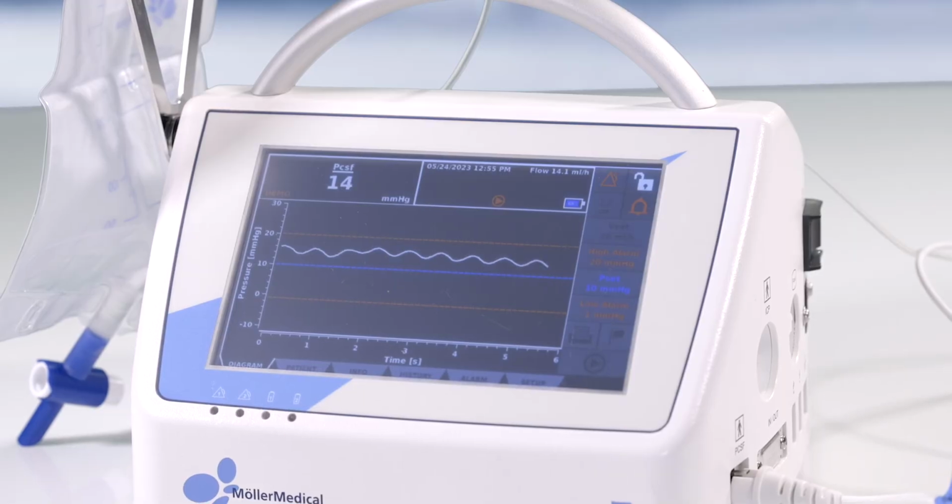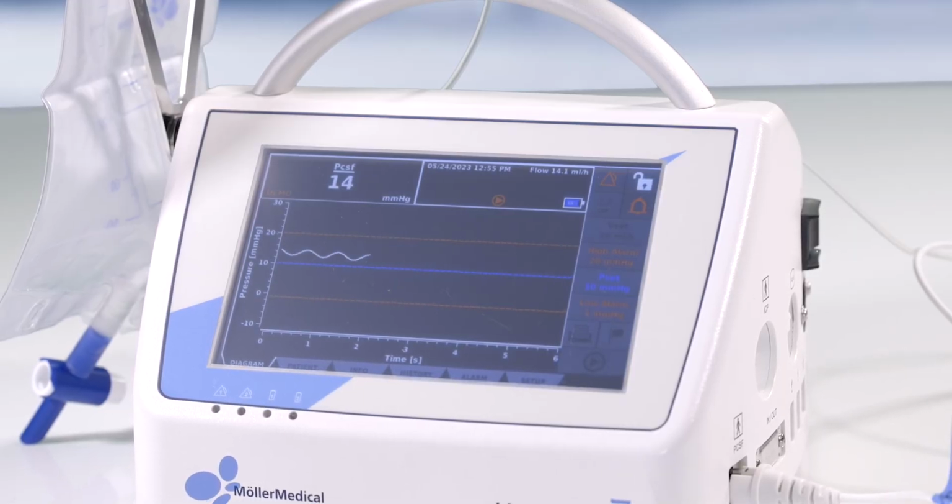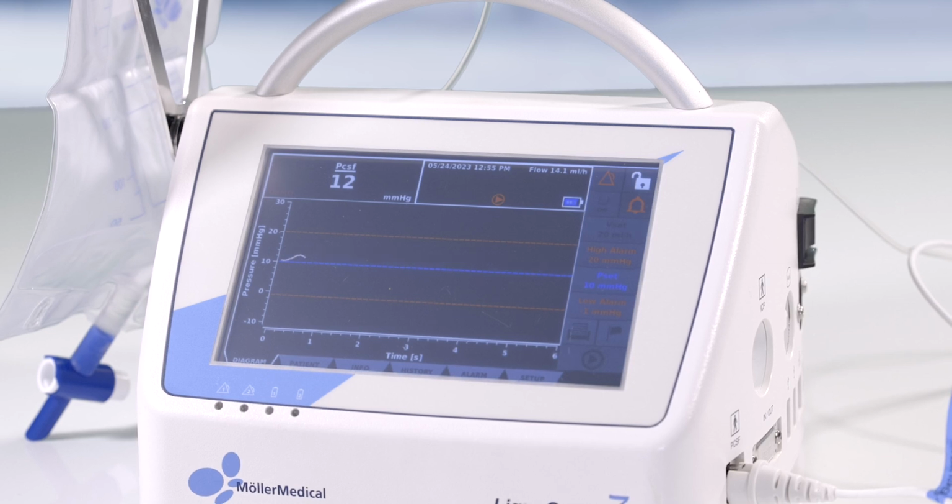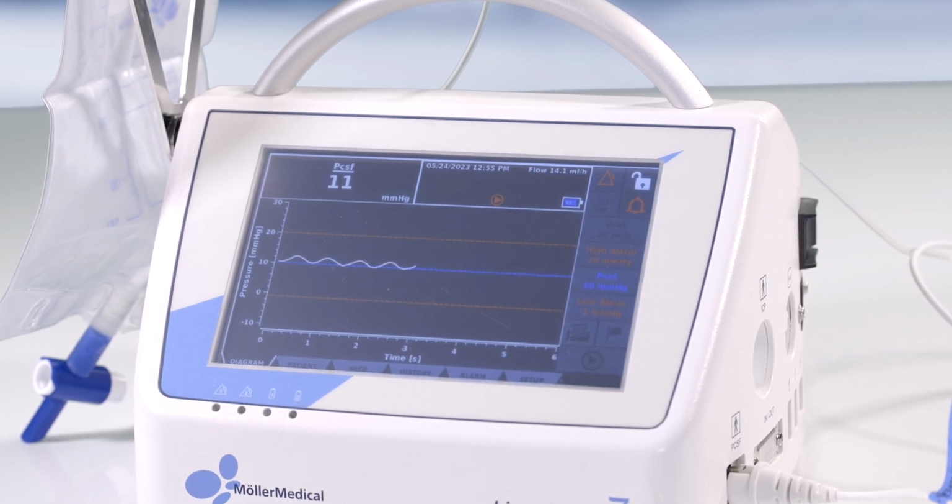When the patient's CSF pressure increases above the value of P set, Liquoguard resumes draining CSF to reduce and maintain the patient's pressure at or slightly below the value of P set.